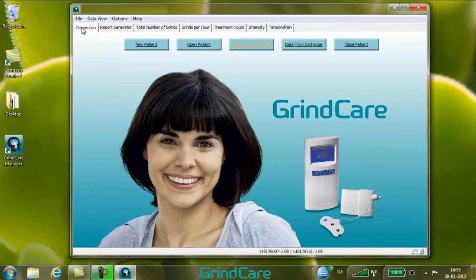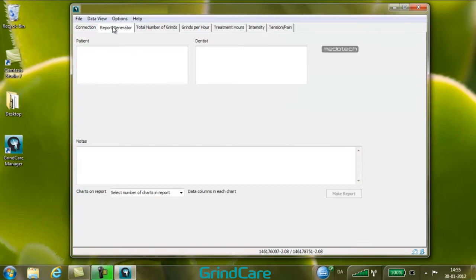To print a one page report, select the report generator tab to the right of the connection tab. Enter the name, address, phone number, ID and other patient information to be printed on the report. The data is saved with the patient file and will be available for all subsequent reports for the same patient.